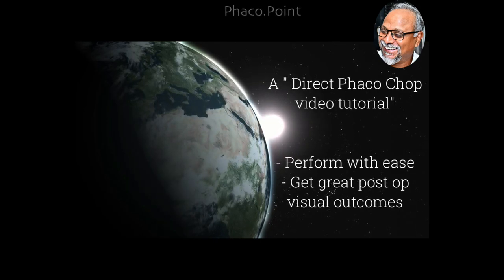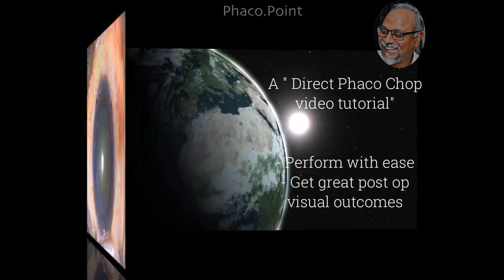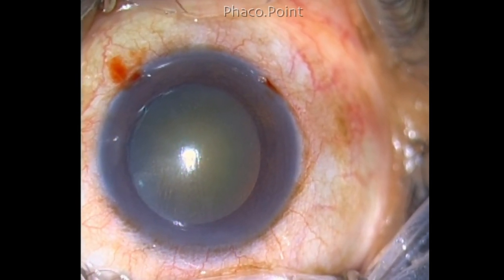Hello friends, in this video let's see how we can optimize the direct fecal chop not only to make it easy to perform but also give excellent postoperative visual outcomes. Let me steer you through every step of the procedure.